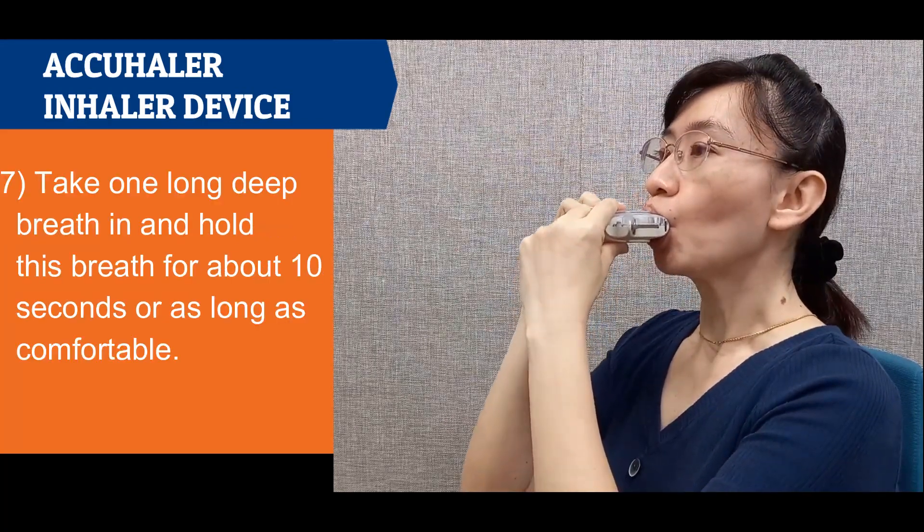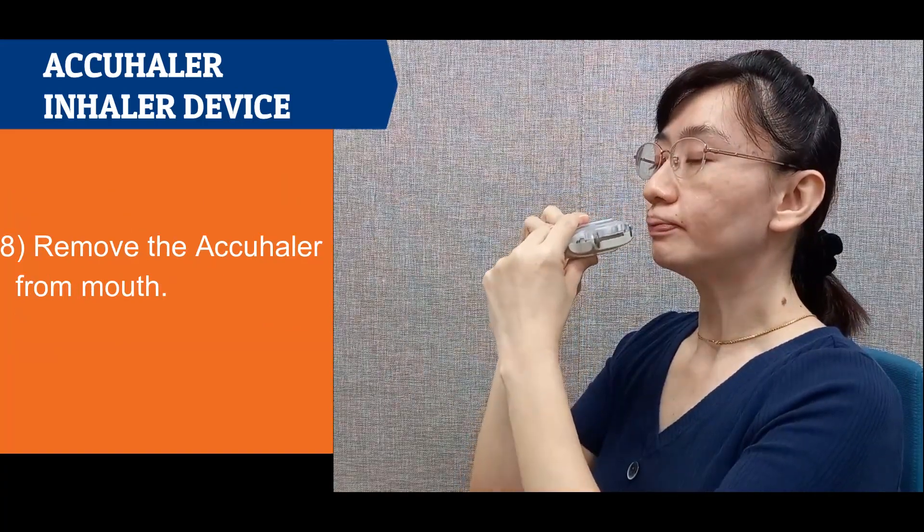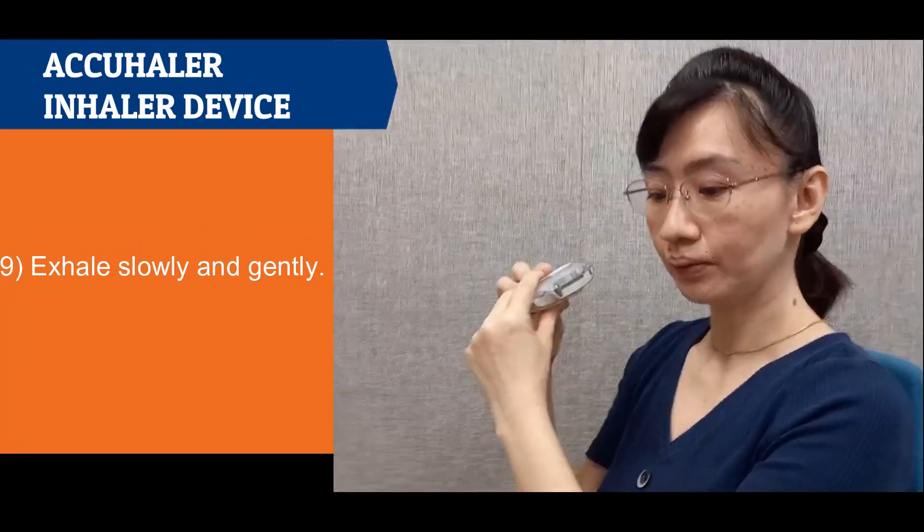Place the mouthpiece between the lips and seal firmly around it. Take one long deep breath in and hold this breath for about 10 seconds. Remove the accuhaler from the mouth, then exhale slowly and gently.